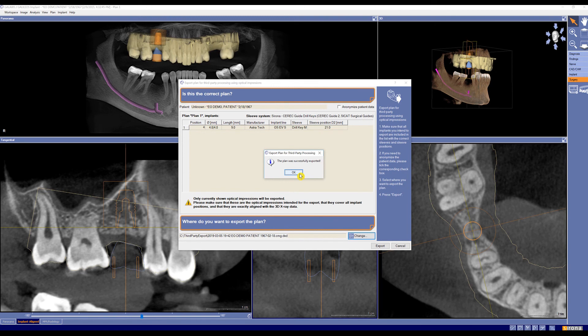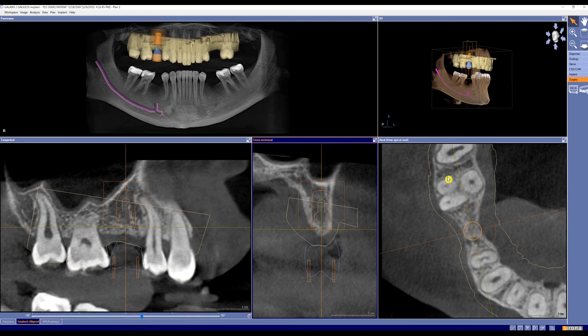The plan was successfully exported. Now you'll be able to access that from your CEREC acquisition unit and get ready for milling.